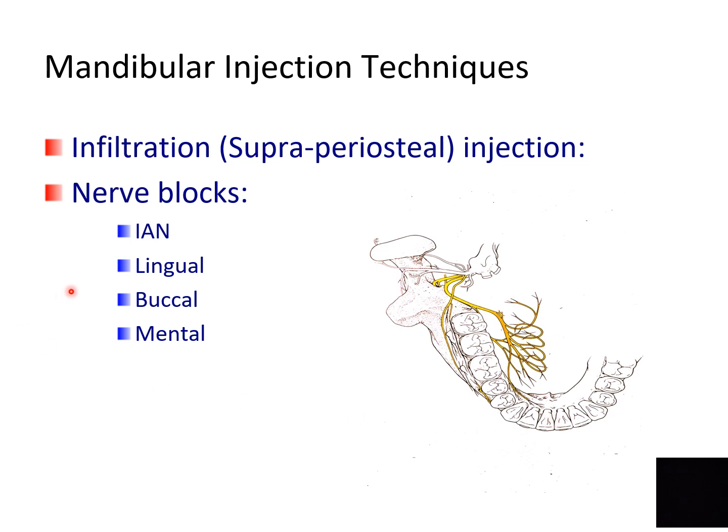So, if you are carrying out restorative treatments in the anterior mandibular region, like fillings and root canals, you would only require a labial or a buccal infiltration.